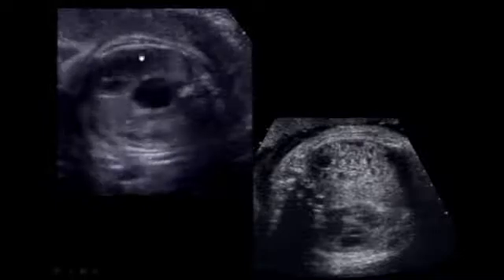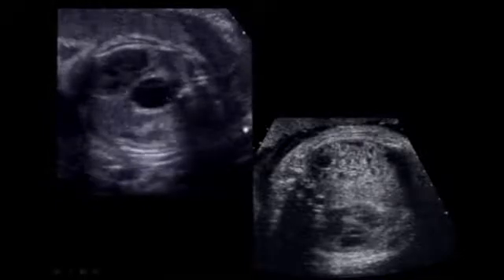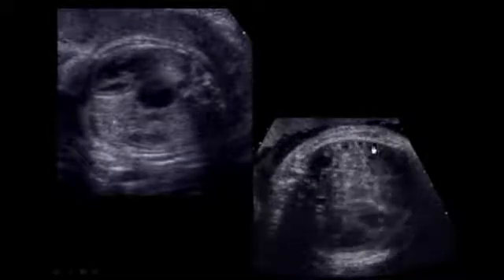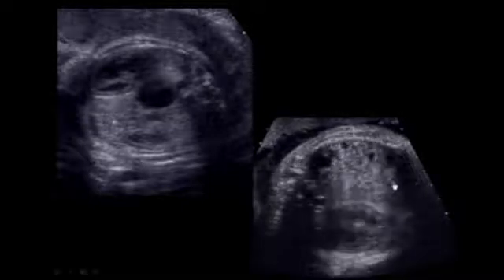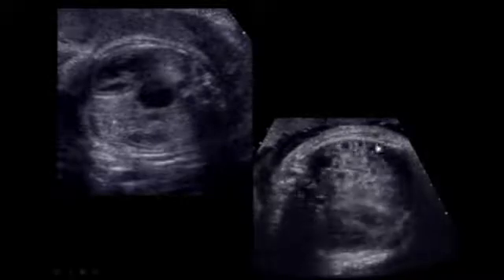So here's a patient with a diaphragmatic hernia. We can see there's a big cystic structure behind the heart. The heart is pushed over to the right. There's a cystic structure here. We're not quite sure what it is, but if we look carefully, this is the same patient with an image from the other side. If we look carefully, we can see this is all peristalsing bowel. So this could only be diagnosed with a video clip or real-time in the room. This could not be as confidently diagnosed with a static image.